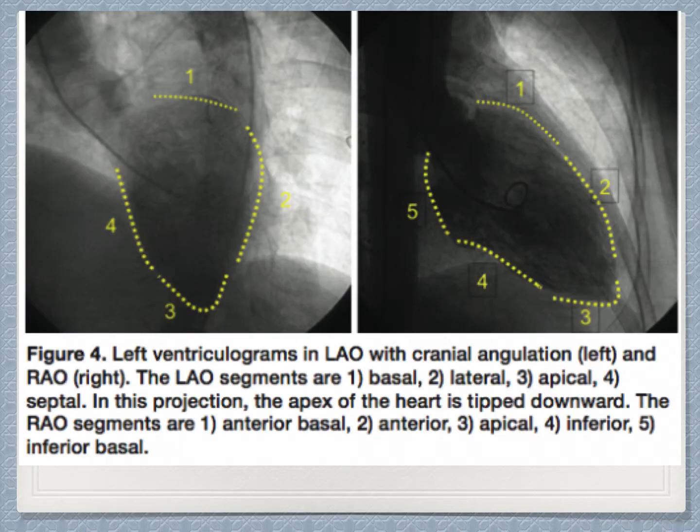Here you can see ventriculography, where contrast material is injected in the heart, and all the left ventricle is painted with contrast material. You can see how in LAO the heart is circular, and in RAO, on the right side of the image, you can see almost all the left ventricle expanded as a cone-like figure.